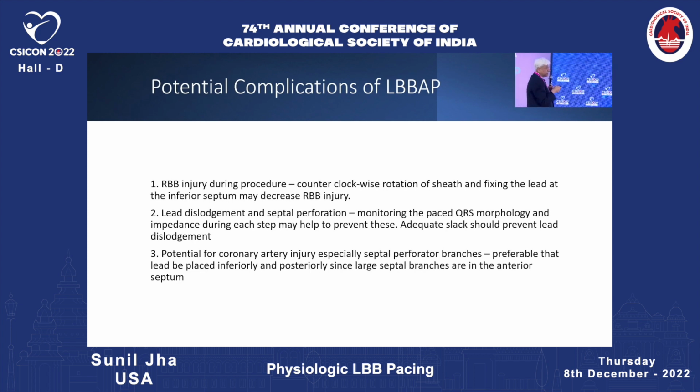So what are the complications of left bundle area pacing? You may have right bundle branch injury during the procedure. When you do the counterclockwise rotation of the sheath and fix the lead at the inferior septum, it may decrease the chance of right bundle injury. The right bundle is mostly in the anterior part of the septum, so you go posterior, counterclockwise. If you have an assistant there, ask him to hold the sheath in the counterclockwise position.